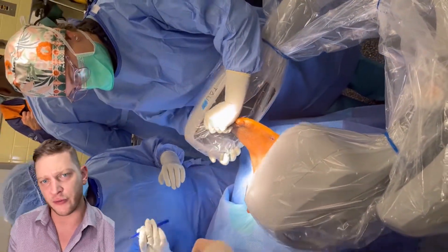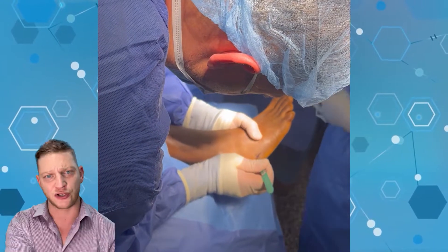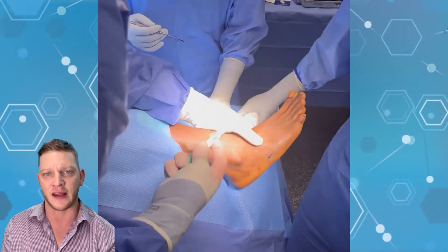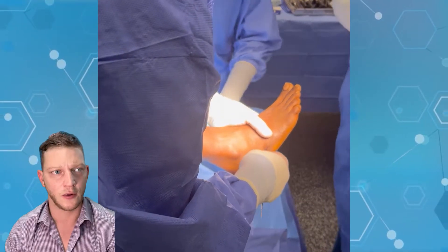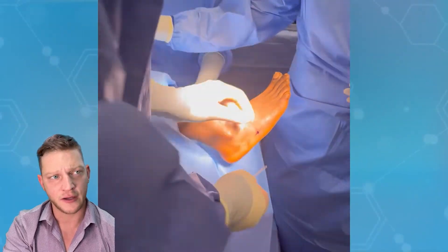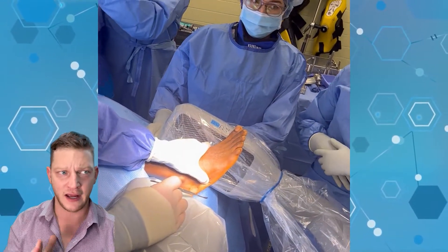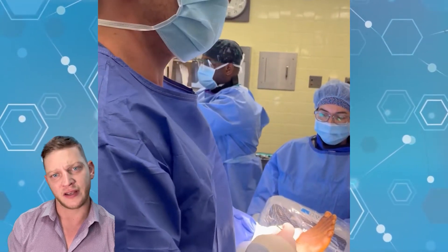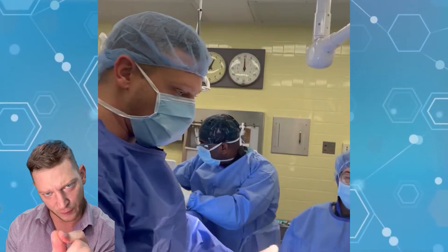We're putting the K-wire through the center of the medulla, which is the center of the bone, so that we get good screw placement. If you try to put the screw in on the first try without a K-wire, you're going to really destroy the bone — I'm worried about making Swiss cheese out of it. The goal is to get it through both fracture fragments in anatomic alignment so that the screw following that same borehole can actually compress the two pieces together.